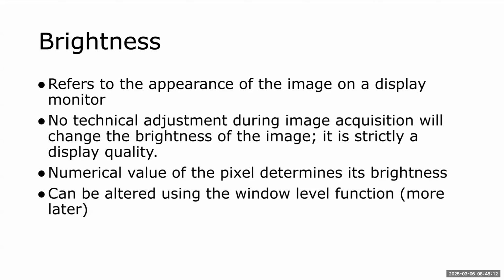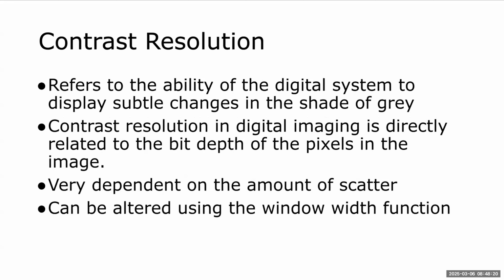And we can also change the brightness of the image through the window level function. So window level controls brightness. And in a minute, we're going to see here that window width controls contrast.